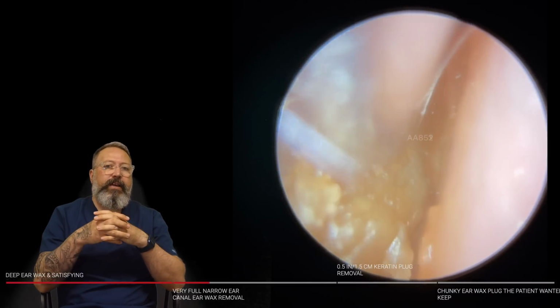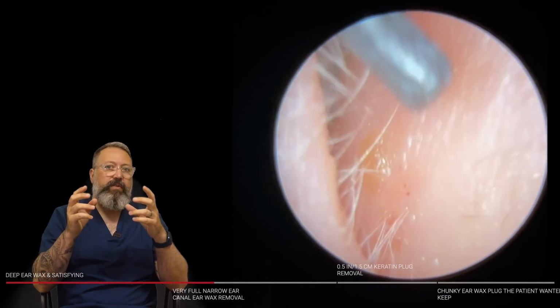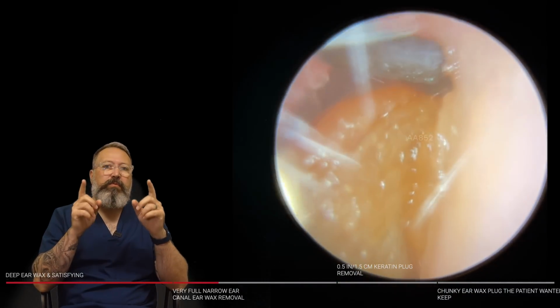So what you've got then is, I'm trying to use the standard size tube in here. I'm trying to get a grip anyway, basically, on this to try and maneuver this out. It's not really budging. So St. Bart's hook, I think that's two videos in a row now this guy's appeared in. So perfect for this one. We've got a gap at the top.